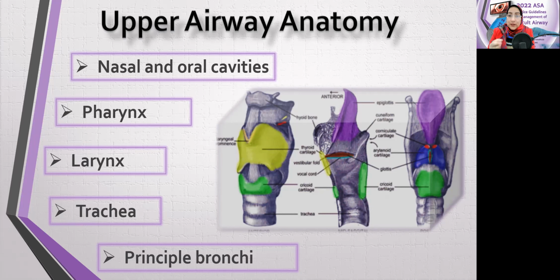So be careful when you're doing nasal intubation or placing a nasopharyngeal airway. You have to lubricate it well, so as not to injure any of the blood vessels, or you will have horrible bleeding.